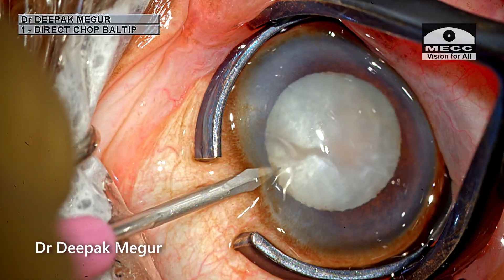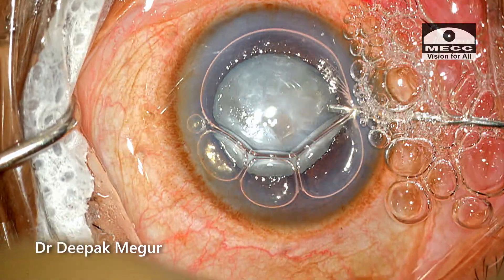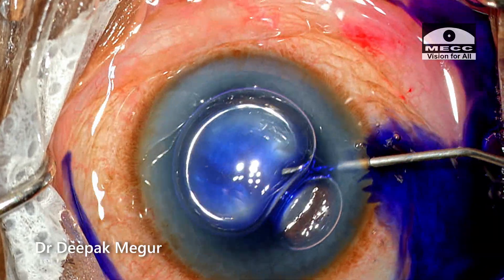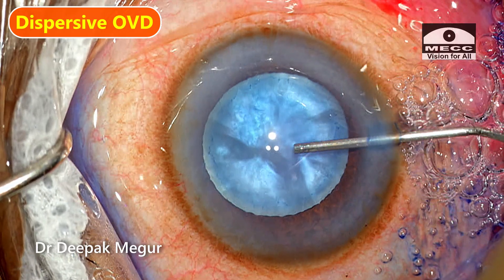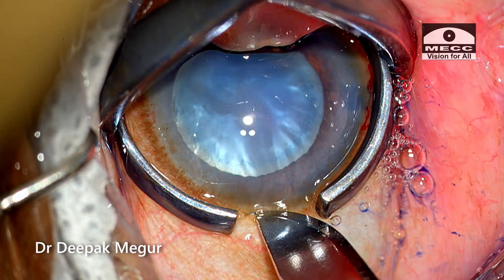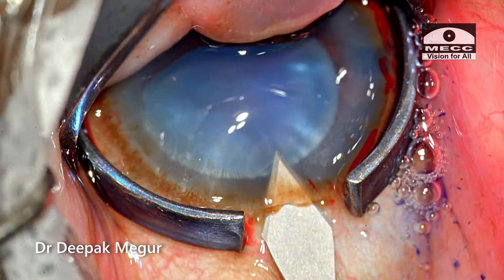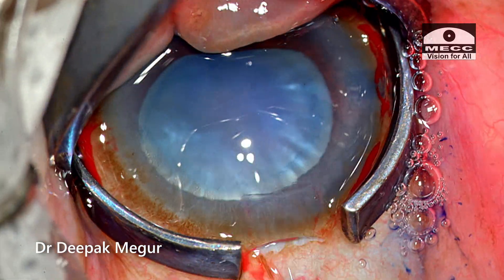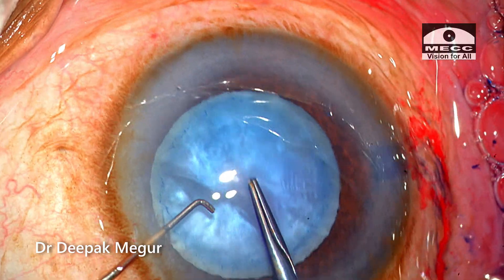I'm starting my surgery by making the paracentesis incisions. The capsule is stained. The chamber is deepened by using dispersive OVD. The main wound incision is created, and I'm beginning my surgery with the capsule rhexis forceps.